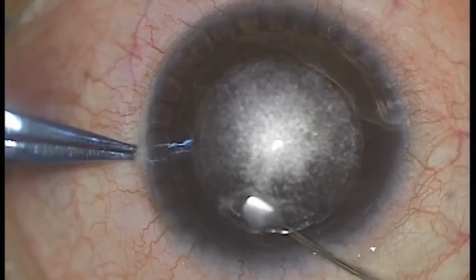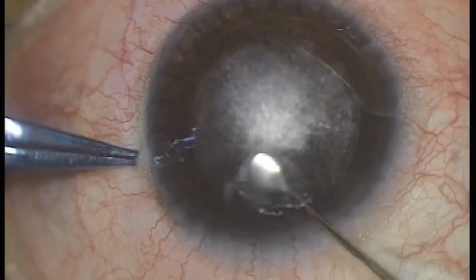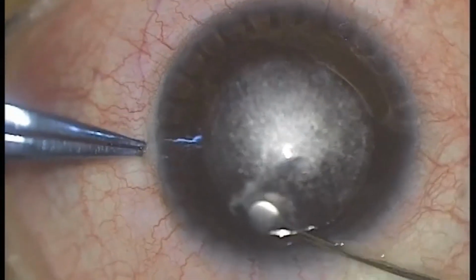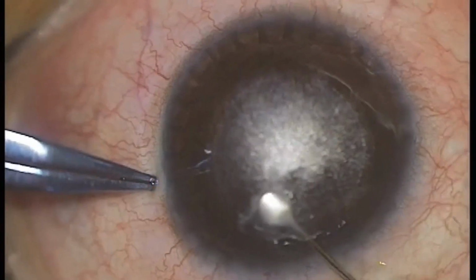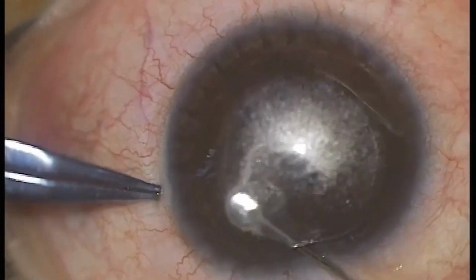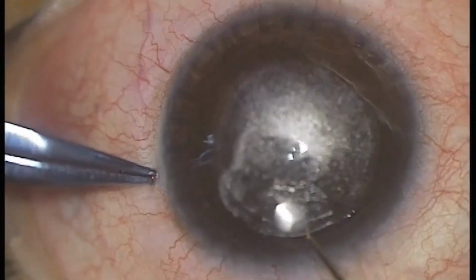Once the blunt dissector was introduced, there was absence of ridge sign with increased resistance noted at the initial step itself. This confirmed lenticular misdissection, that is unintentional initial posterior plane dissection.